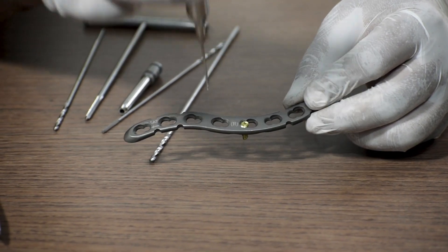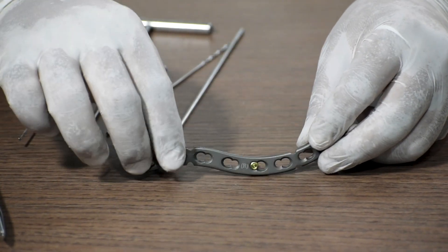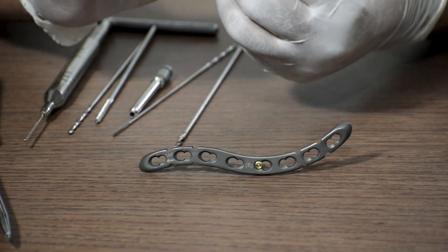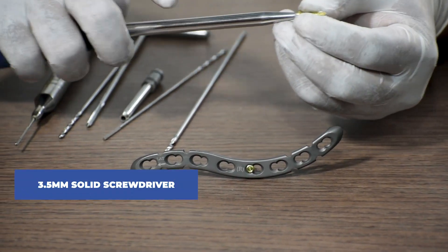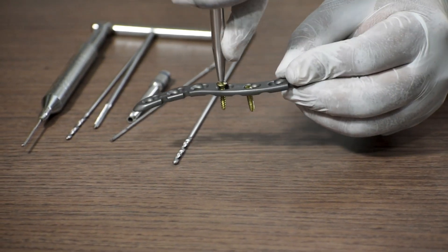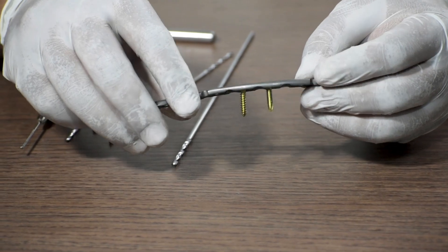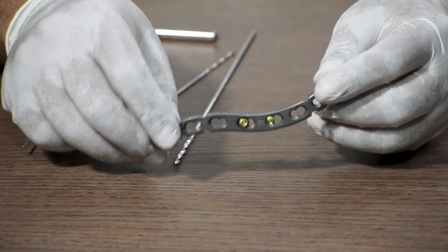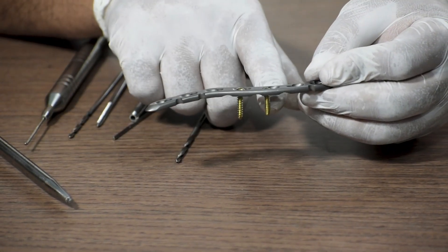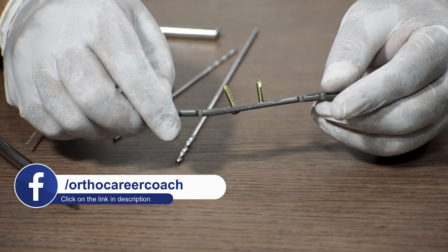A quick tip: if the length of the locking screw is 16 mm, the non-locking screw required should be 2 mm more, so the cortical screw used will be 18 mm. We again use a 3.5 mm solid screwdriver, connect the 3.5 mm cortical screw, and fix it in the non-locking hole. For cortical or non-locking screws, it only gets fixed in the bone and not the plate — unlike the locking screw, which is locked in both.